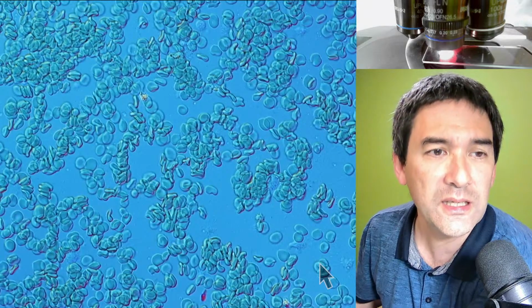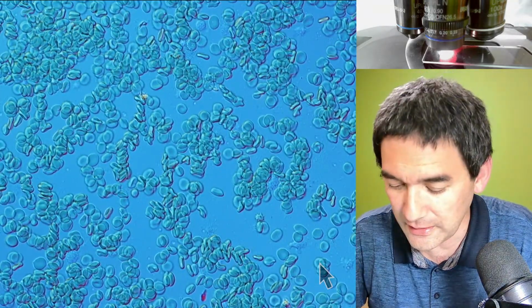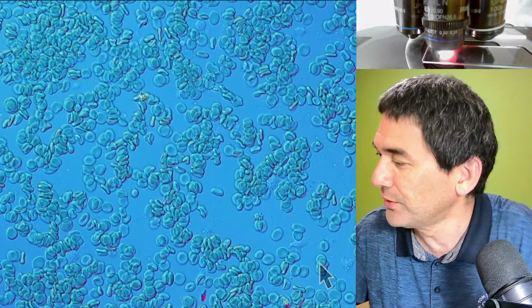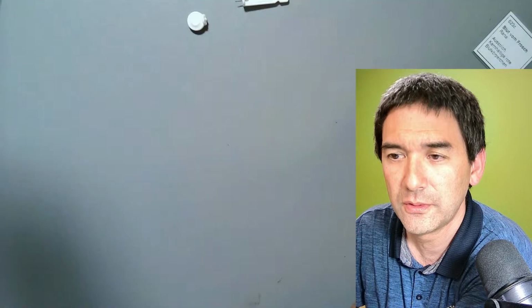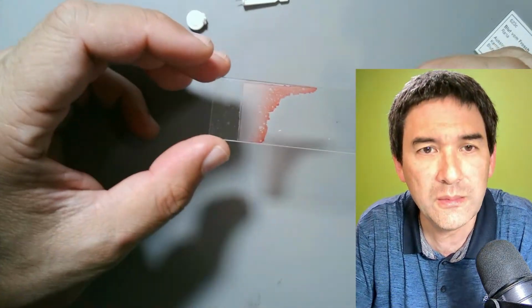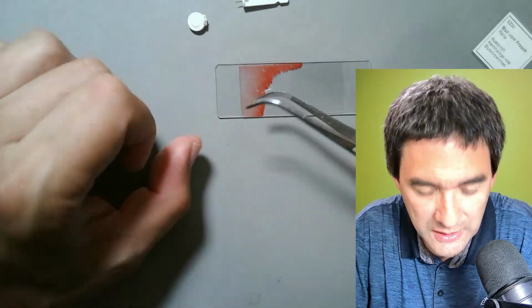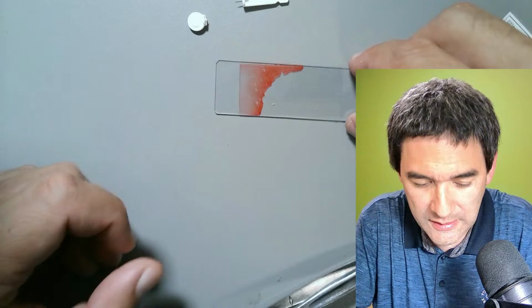Okay, so let's move on a little bit. I think I have to draw again a little bit of blood, and then I would like to do a little bit of staining as well, and then let's see how this actually works out. Let me show again the desk view, and let's see how much the blood has spread in the meantime. Actually, in some cases, I've seen the blood spread even more. So let's try it again.